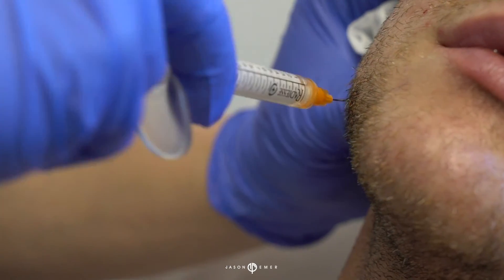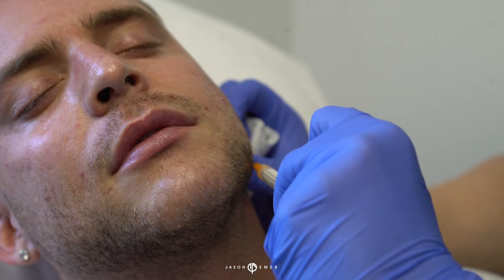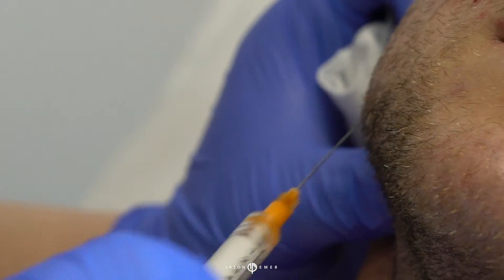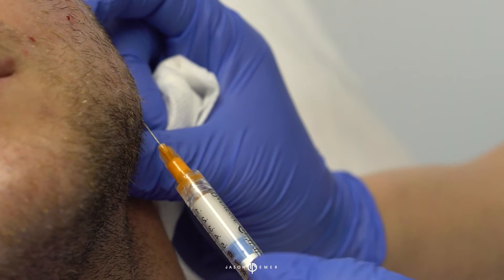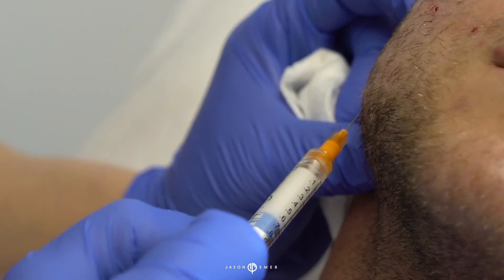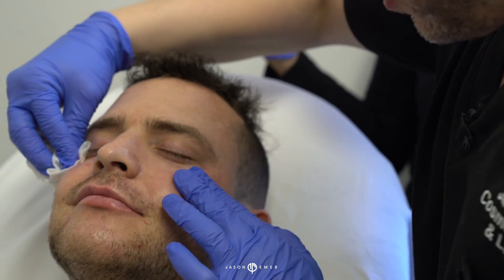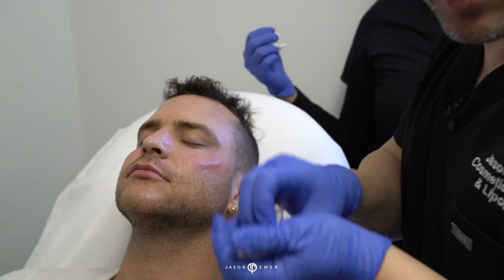Now we're going to the jawline, going right back to the edge of the jaw — a little bit further back onto the actual lateral part of the jaw — placing just a little bit of product right at the border, the junction, to give you the shape we're trying to create. Now going in a vertical direction to give more support to the tissue. We're done now with the facial fillers: we did the lifting in the mid face, a little bit to the lips, the finish of the chin and the jawline.